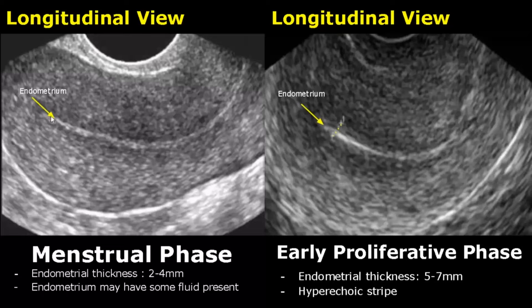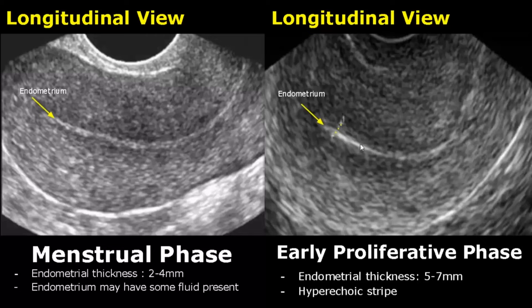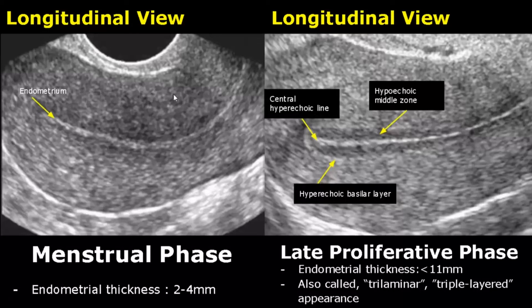The first phase is the menstrual phase in which the endometrial thickness is between 2 to 4 mm and there may be some amount of fluid present, which is normal. In the early proliferative phase, the endometrial thickness is between 5 to 7 mm — the endometrium just appears as a hyperechoic stripe. The menstrual phase image is used just for comparison.